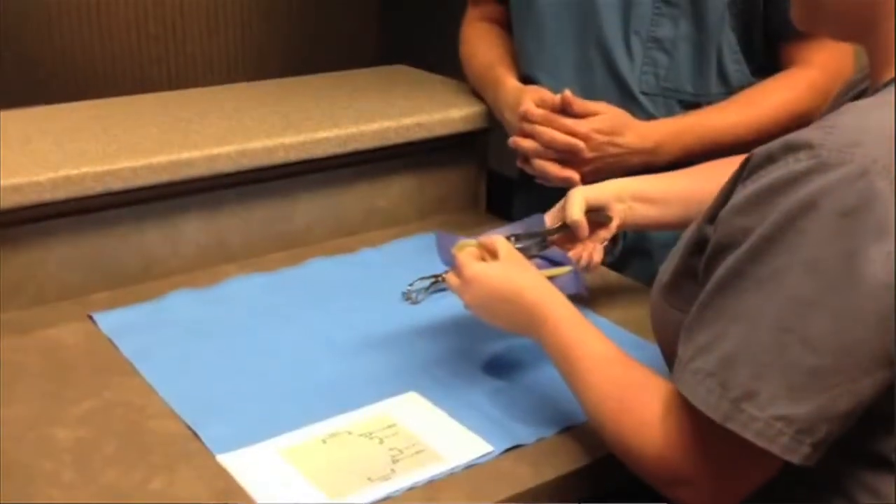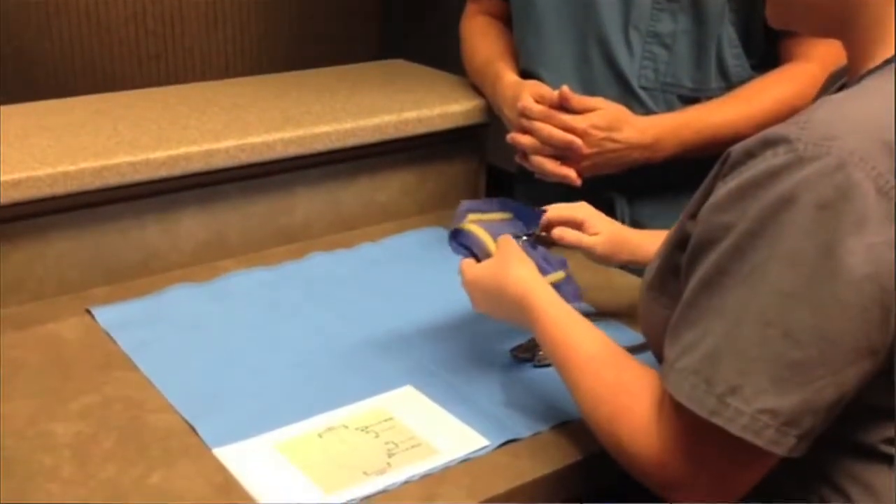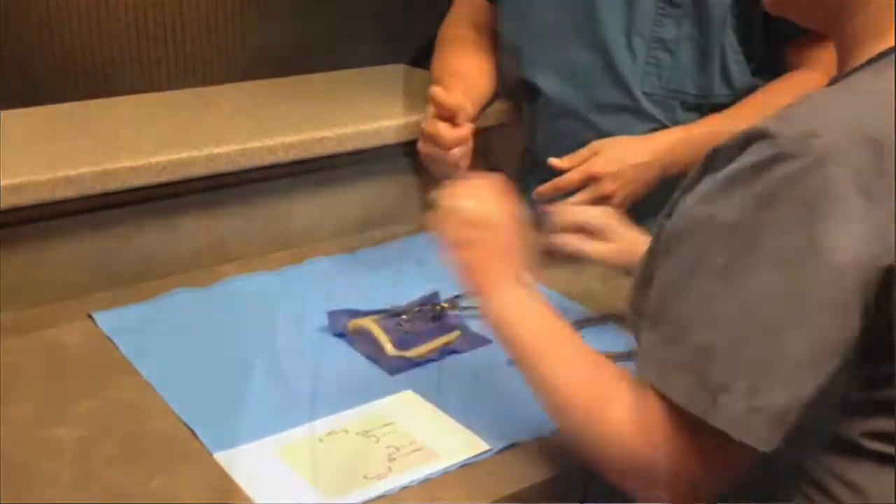Rubber dam isolation is one of the most important steps in root canal therapy. Without it, bacterial contamination will occur resulting in a less favorable outcome. The rubber dam allows the clinician to perform root canal therapy safely and with less stress. Minimizing the number of clamps used will make this step less difficult and more efficient.